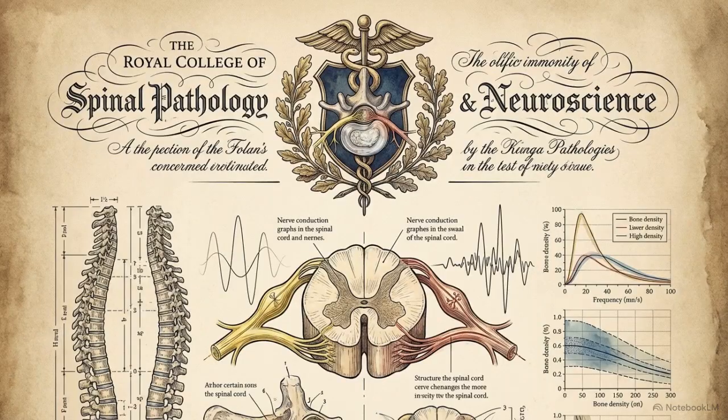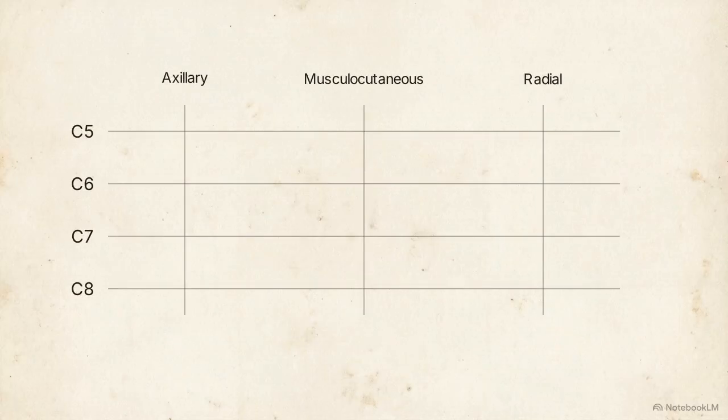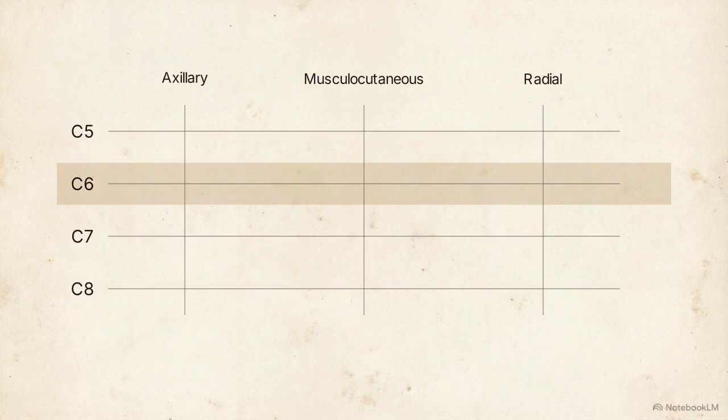The American Association of Neuromuscular and Electrodiagnostic Medicine has established strict criteria for this procedure. An examiner cannot diagnose a radiculopathy based on a finding in a single abnormal muscle. To meet the threshold, abnormal activity must be found in at least 2 different muscles sharing a myotome. Using this matrix grid, notice the critical caveat.